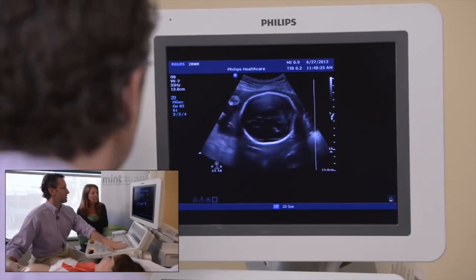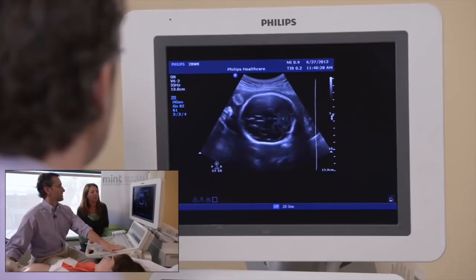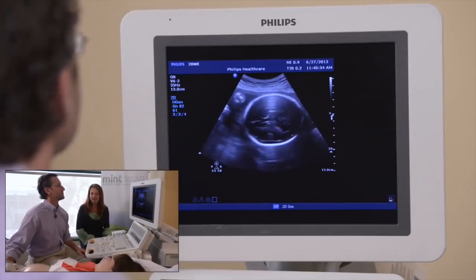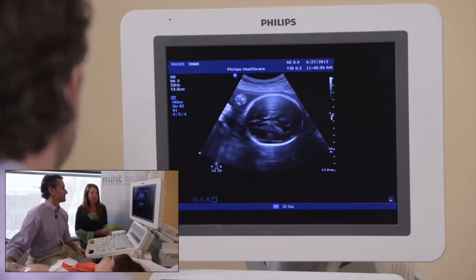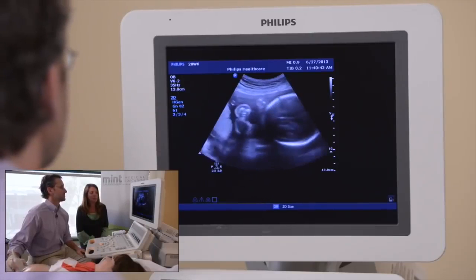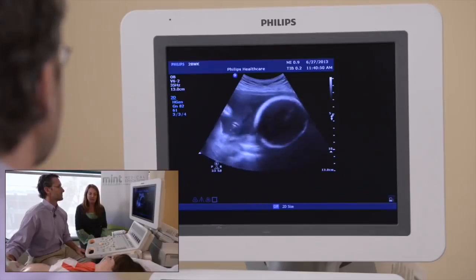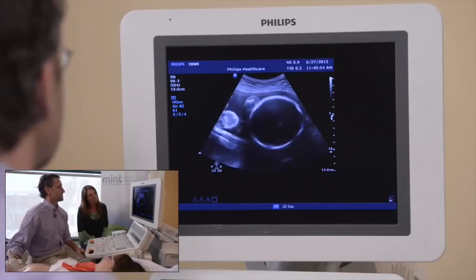Well, obviously you could speak for weeks on what is covered in the 20-week anatomy scan and what would be the difference between normal and abnormal, but we really just want to cover the basics as to what is on that checklist of a normal anatomy scan that we would expect to see on a healthy pregnancy, and also some of the more important landmarks, so we get our measurements done in the same location on all the babies. So great.